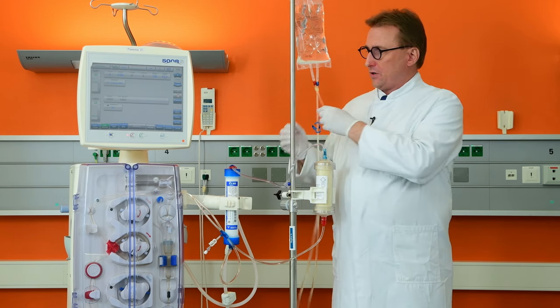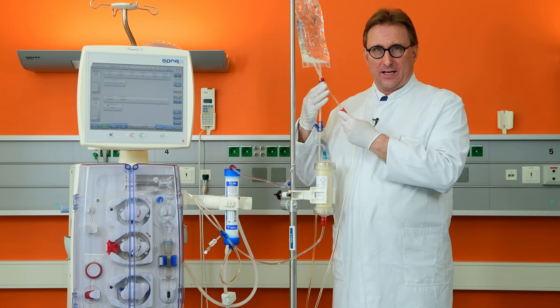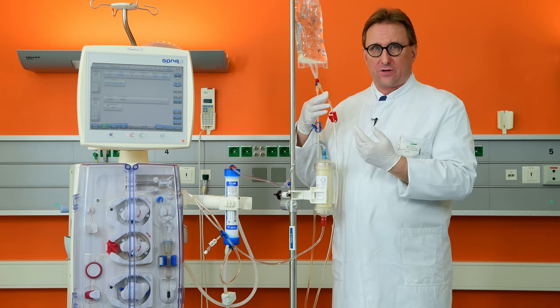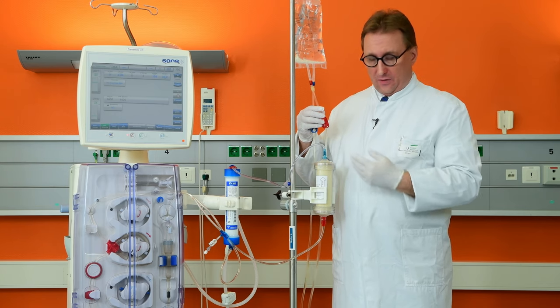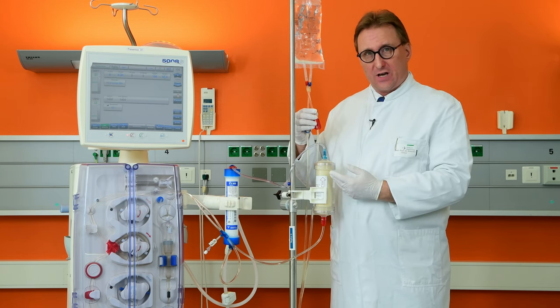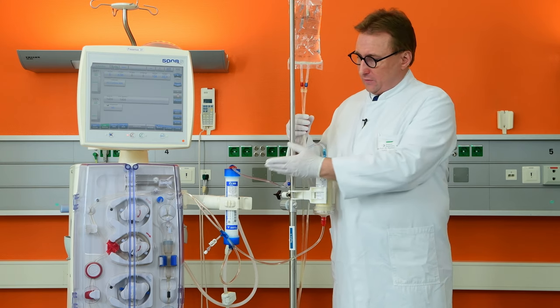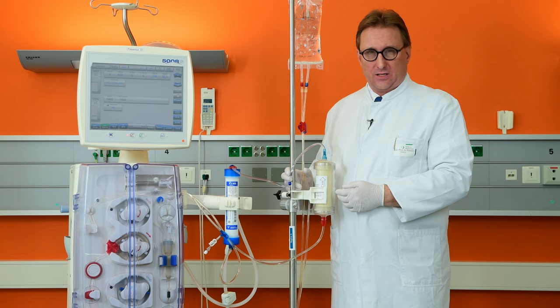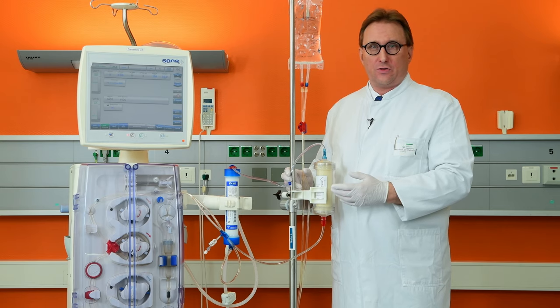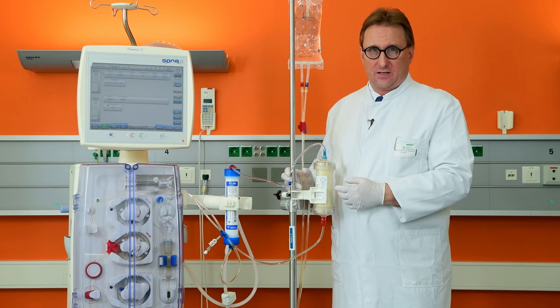Now you can connect the arterial bloodline to the central venous catheter or dialysis fistula of your patient. The blood will then first go through the Seraph and afterwards through the dialyzer of the regular dialysis machine. I wish you the most possible success for the treatment.